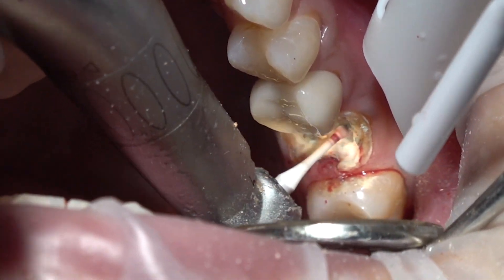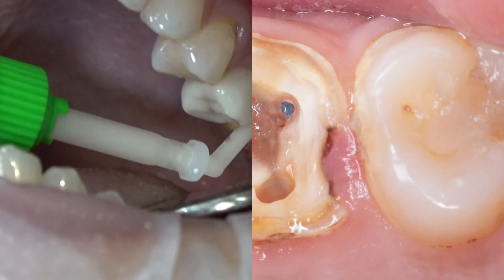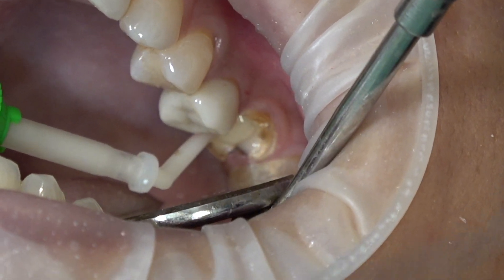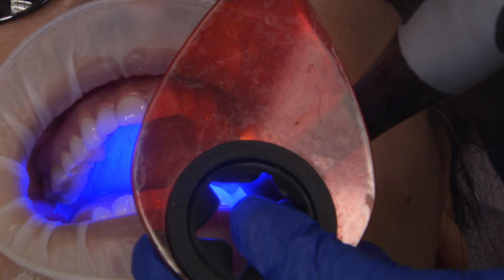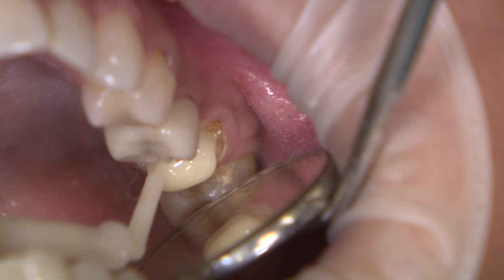TICOR Auto-Dual Cured Reinforced Core Material from EDS is used to create the core buildup. It is easy to place in layers, has minimal slumping, and delineates well from tooth structure. It feels like dentin during crown preparation, which helps to prevent unwanted ditching and undercuts.